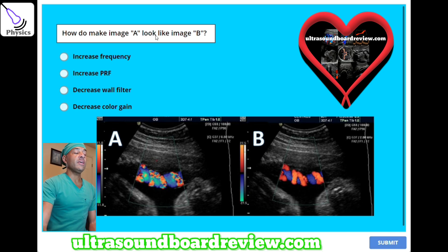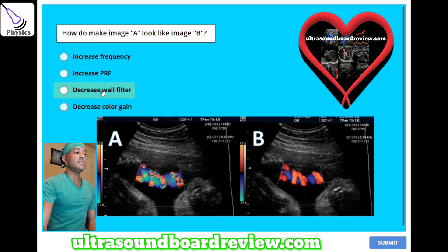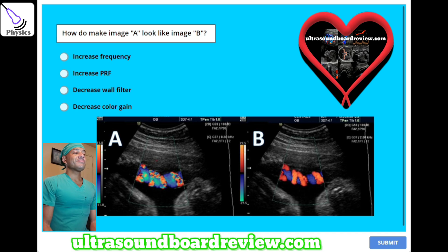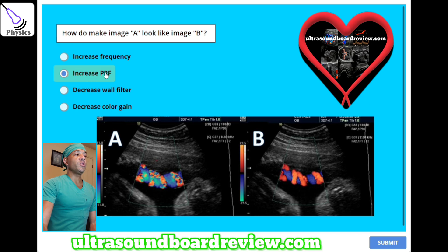How do you make image A look like image B? A, increase frequency. B, increase PRF. C, decrease wall filter. Or D, decrease color gain. The answer is B — increase PRF to eliminate this aliasing Doppler artifact.